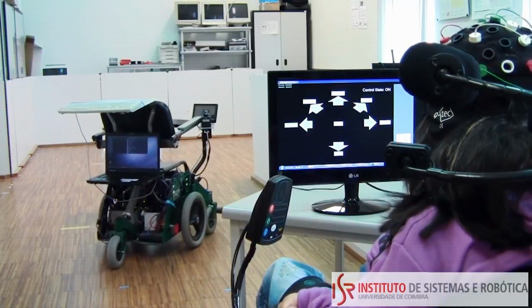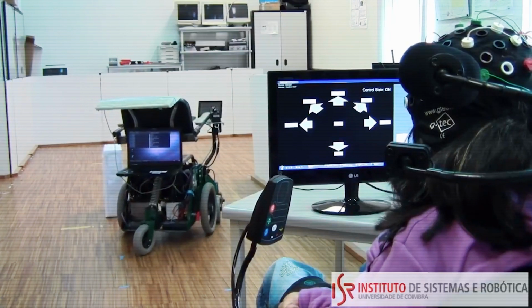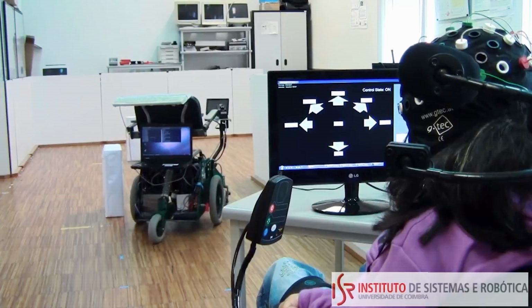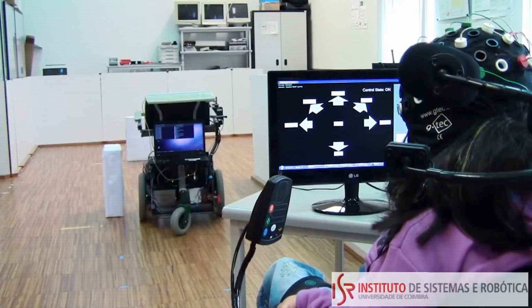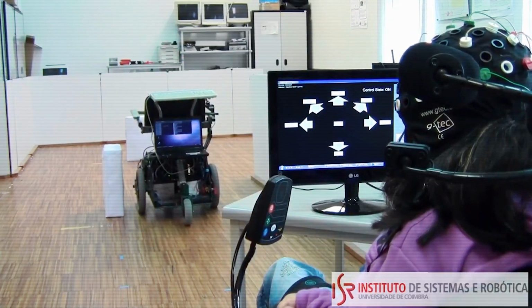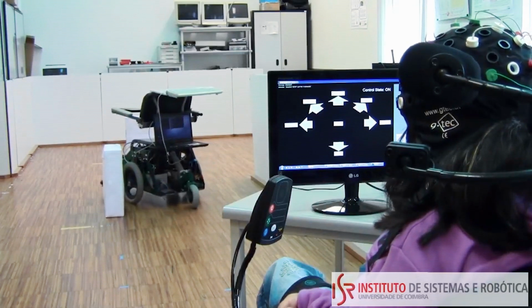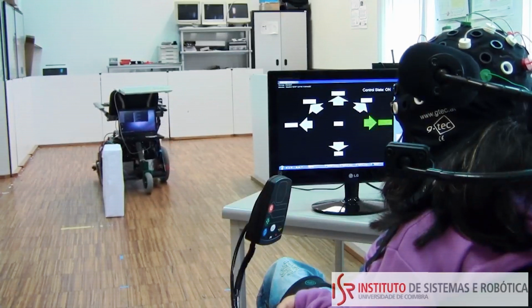In brain-computer interfaces, all of the commands from which the patient can select are displayed on the screen at the same time. The commands are then highlighted one by one, and the patient, having picked the command that he requires at the time, somehow marks the highlighting of the necessary command. For instance, he counts them for himself each time. Averaging occurs in real time and potentials are detected.